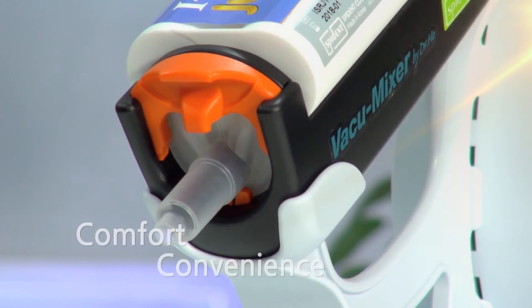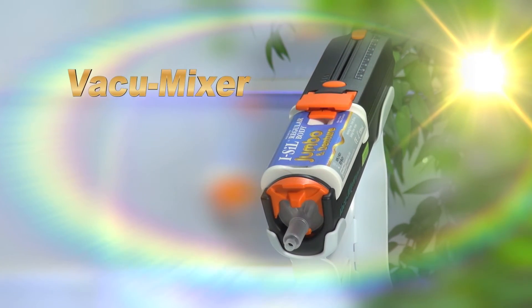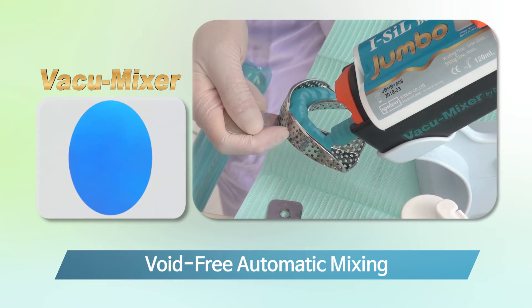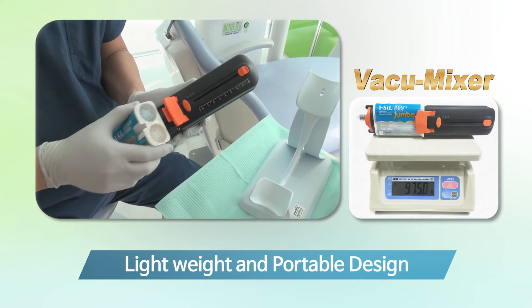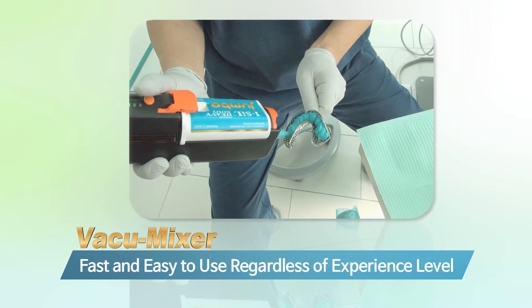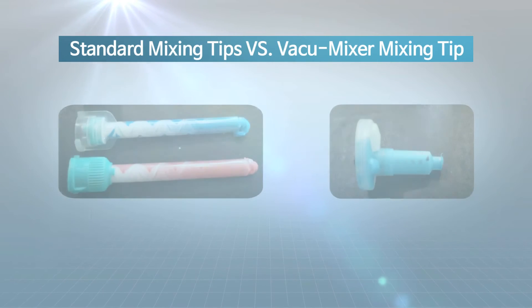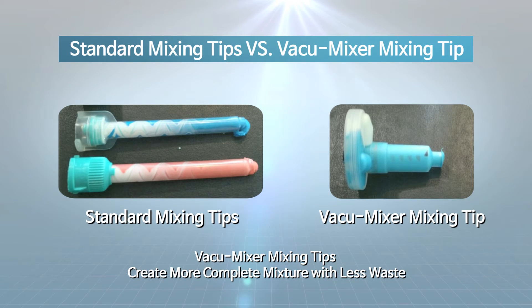The Vacuum Mixer is designed not only with your comfort and convenience of use in mind, but as a solution to existing impression product problems. Its advantages include a perfectly homogeneous, void-free final product due to motorized automatic mixing, lightweight portability, and the ability for even beginners to load a full tray in only 10 seconds, reducing chair times. As seen in side-by-side comparison, Vacuum Mixer's mixing is flawless with reduced waste.